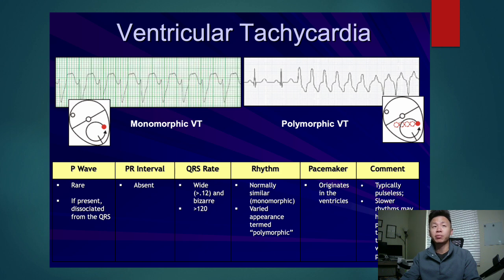That's more of a uniform type of firing. It fires over and over and over in a straight line or round and round, and is presenting to you as this. As you can see here, the main things that we find is there's no P wave, no discernible P wave at all. Or as you can see here, it starts as a P, but then it becomes undiscernible. The QRS is very wide because QRS is that ventricular beat, and that's all you're seeing there. And of course, there's no T wave at all. You can't see that at all because it's completely overlapped by the other QRS waves.